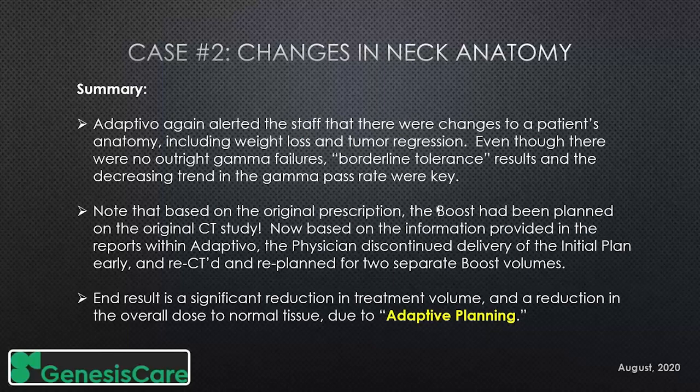But it is my understanding that a lot of the preliminary research and development of the software had been done within 21st Century Oncology in the past before they joined up with Standard Imaging. So I believe that might have had a lot to do with why we are using Adaptivo.